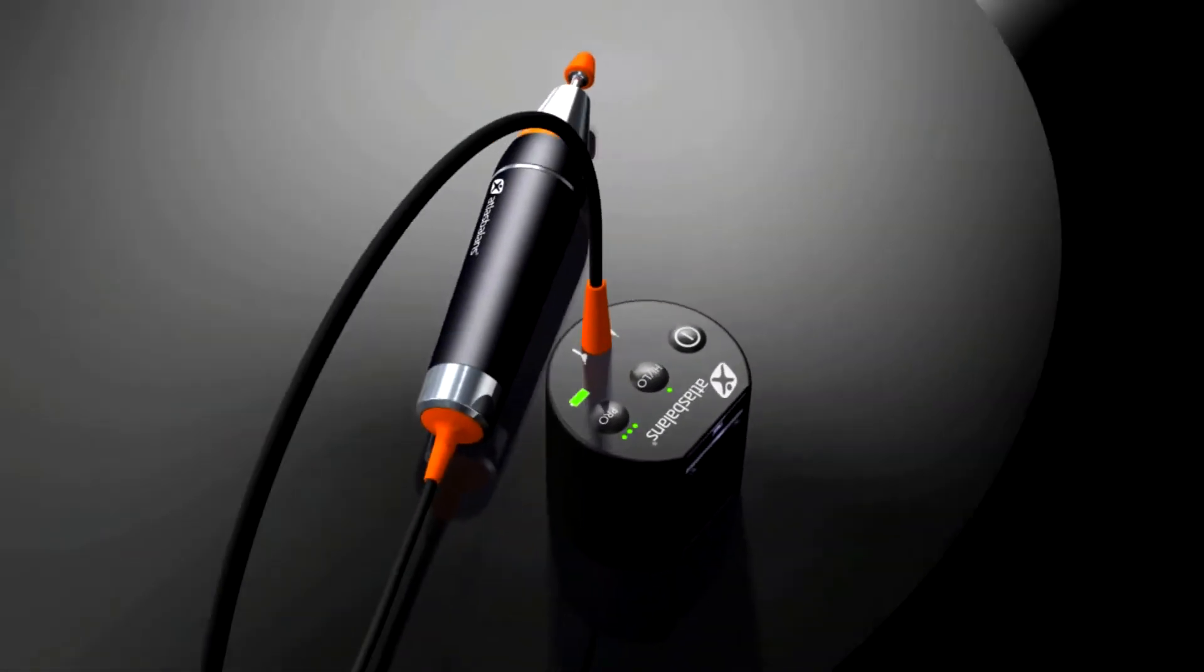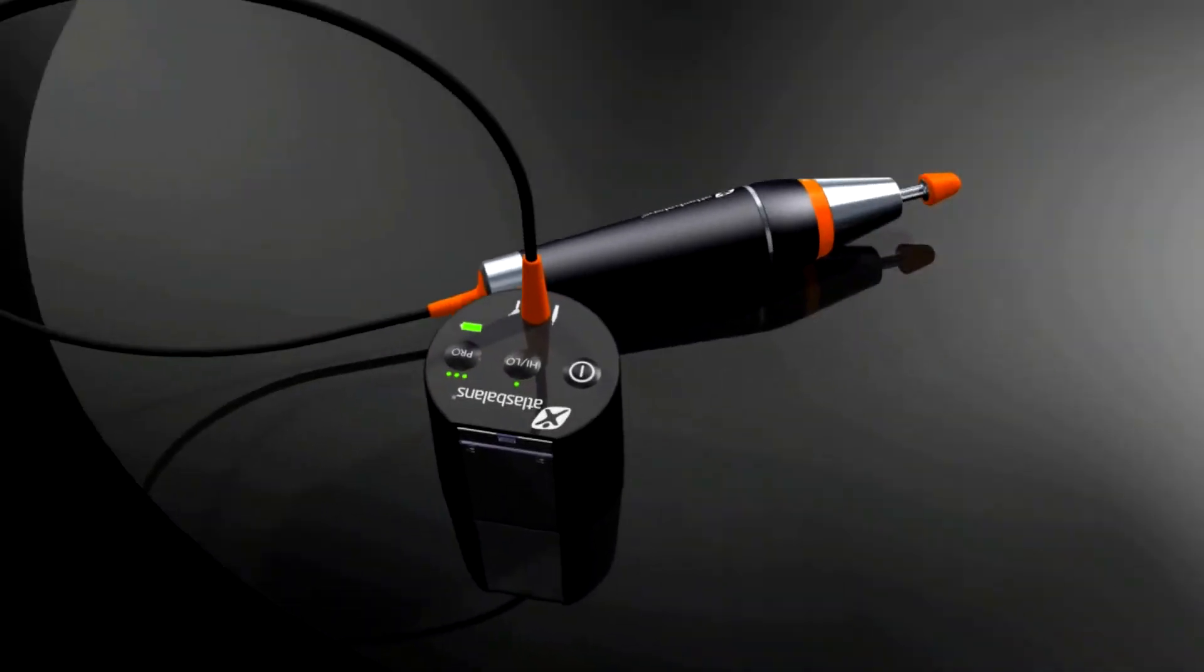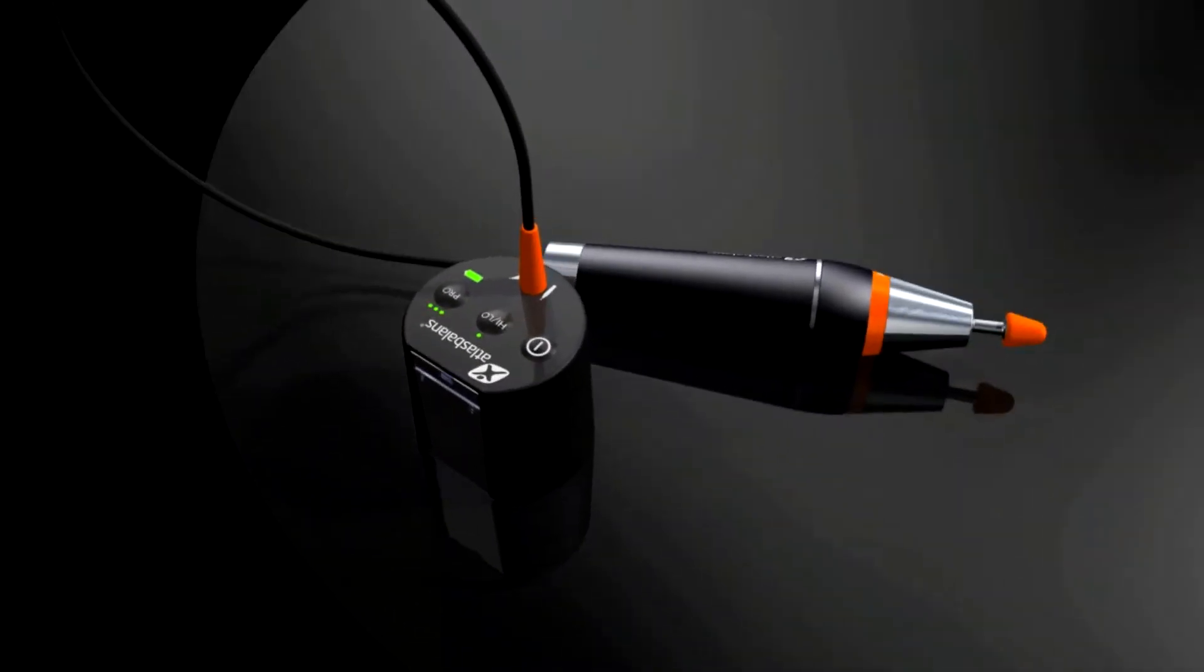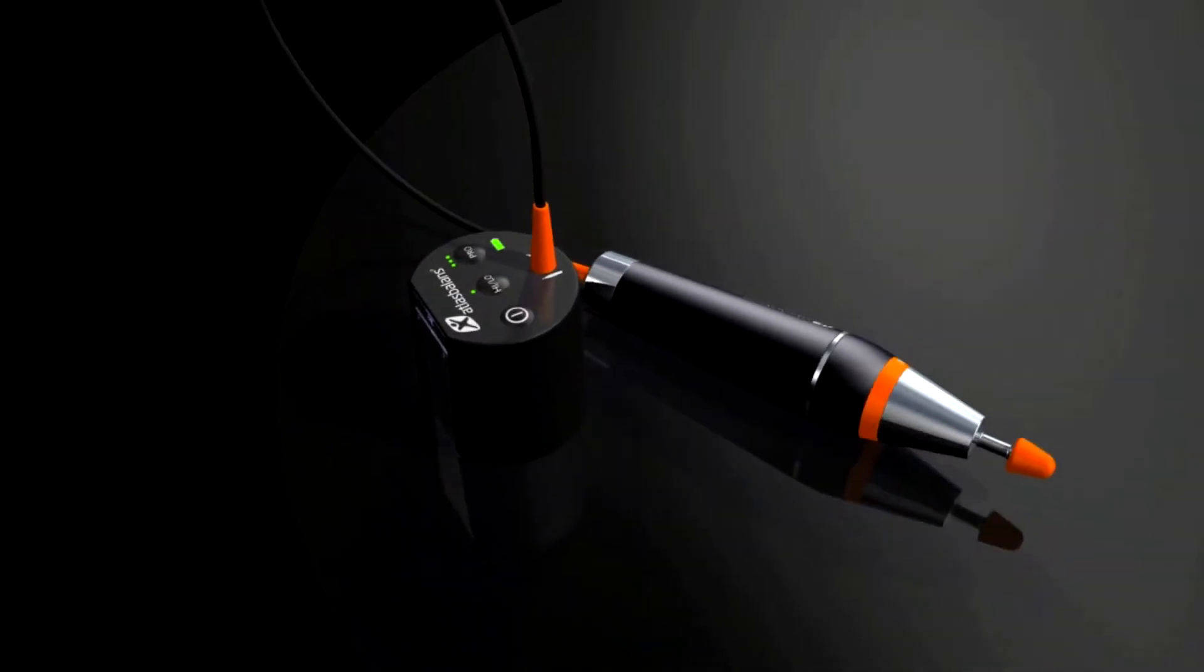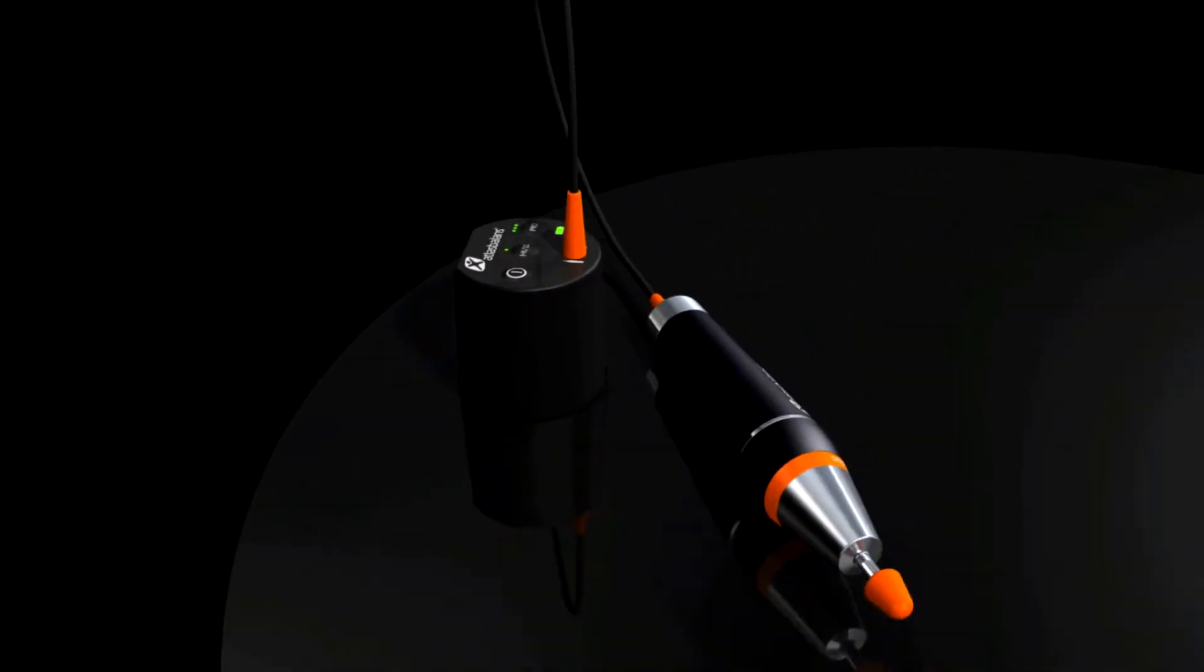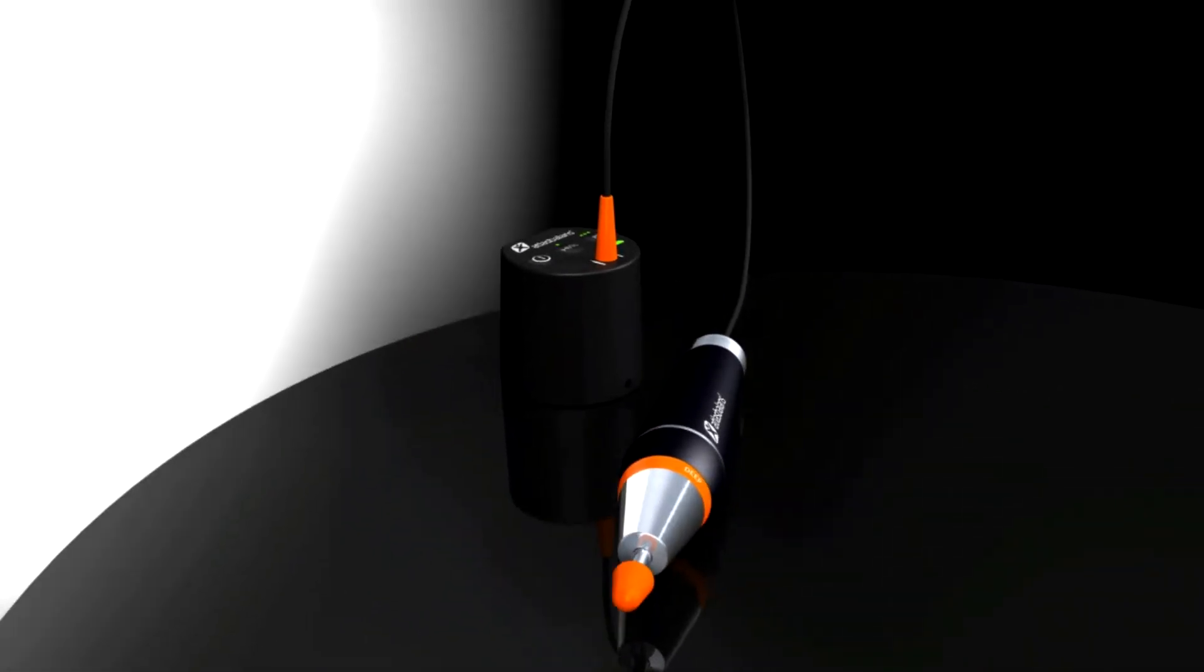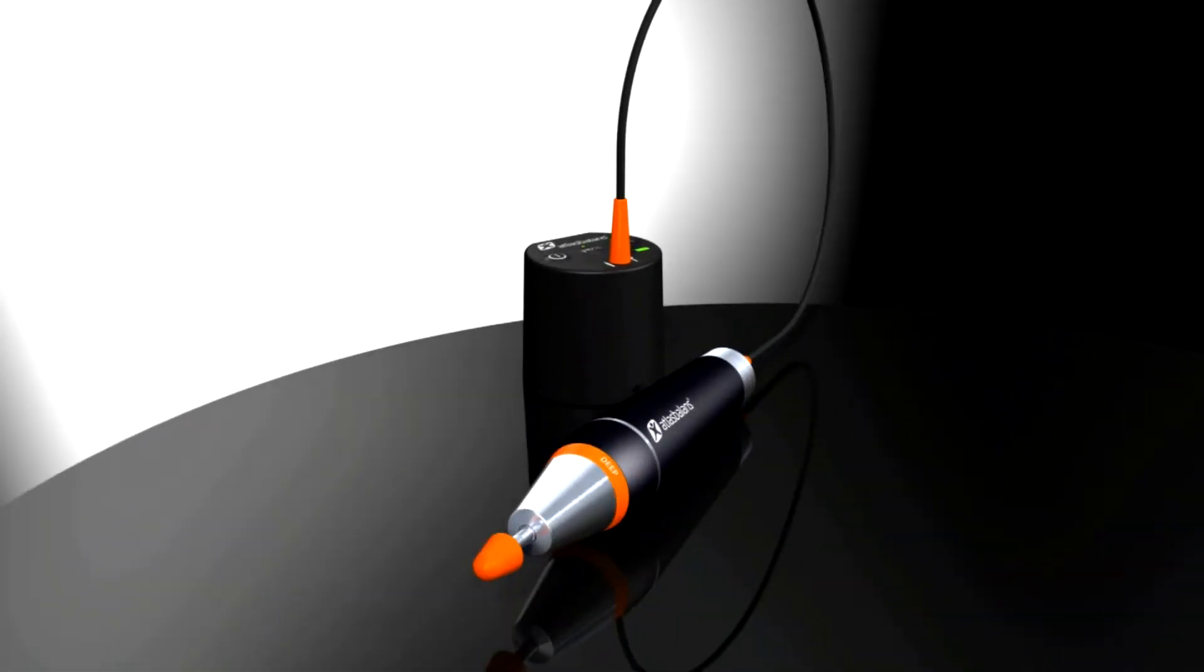Designed as an extended hand, the powerful M1 brings a new level of professionalism to manual treatment. Based on the latest anatomical research, it is optimized for advanced and effective fascia treatment.